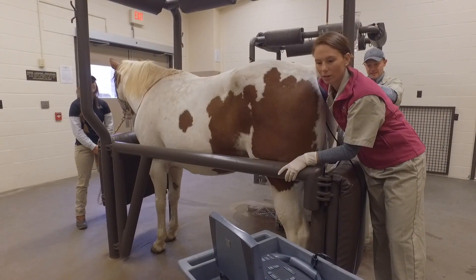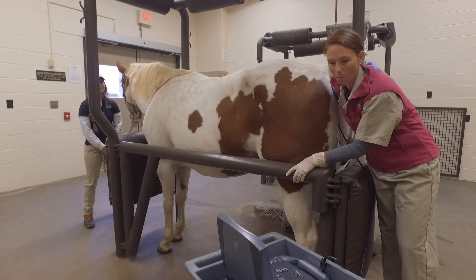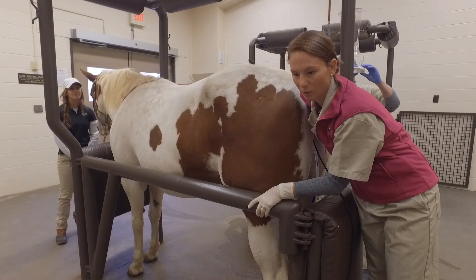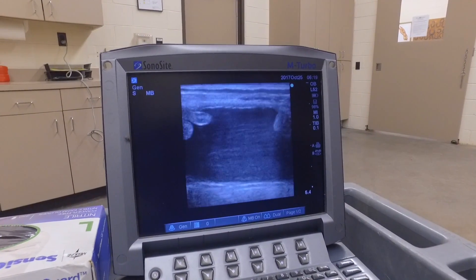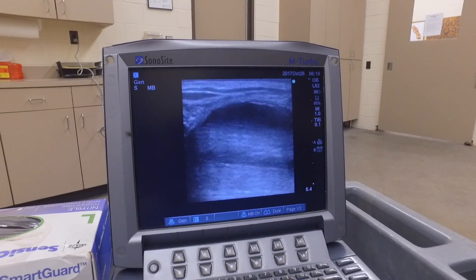So I'm scanning the uterus to make sure that both horns are filled with fluid and also the uterine body, just to make sure that I've distended the entire uterus during this procedure. You can see all those black areas in the uterus there — that's all fluid that we've placed into the uterus.